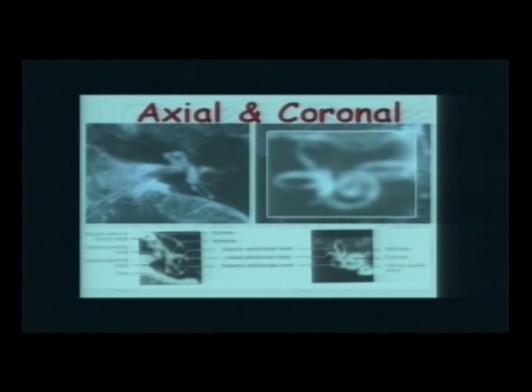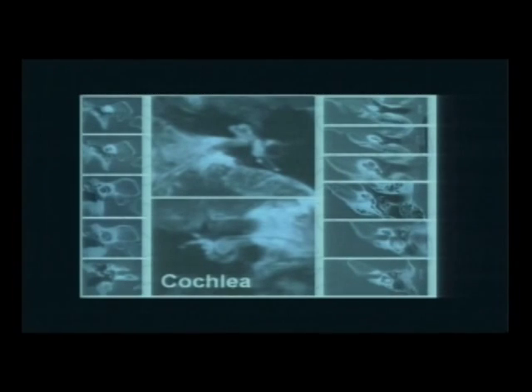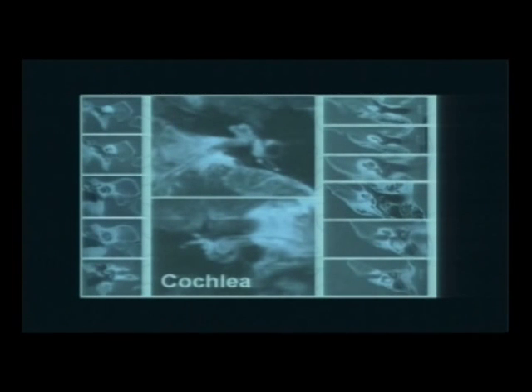This is a more close-up look at the whole turns of the cochlea. And I'm going to summarize everything in this slide. You see, I put an axial MRI here, and I imagined that we are taking vertical cuts, coronal cuts like that, and see what comes out in the CT scan. These are CT scans. Coming from anterior, you see the apical turn, and so on.